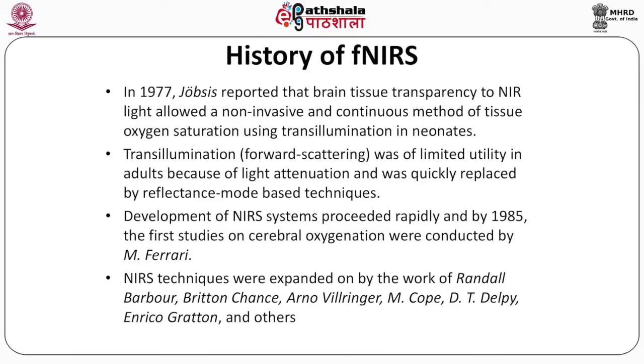Before going into any neuroimaging technique, we should know a brief history of how the technique evolved over various time periods. So, first let us talk about the history of FNIRS. Way back in 1977, Jobsis reported that the brain tissue transparency to near infrared light allowed a non-invasive and continuous method of monitoring tissue oxygen saturation using trans-illumination in neonates. He studied it in neonates.